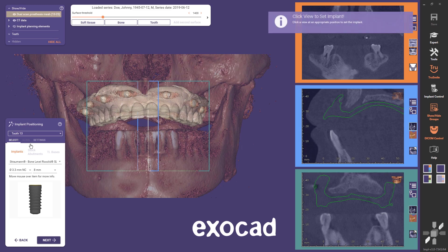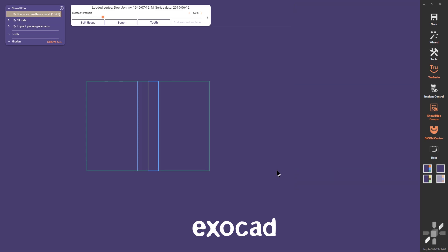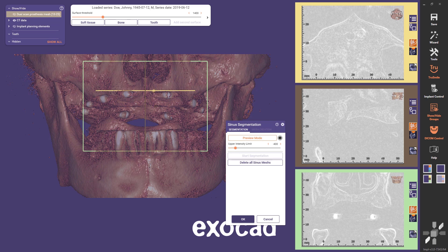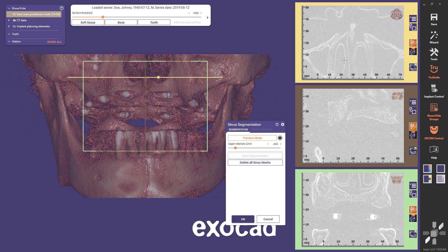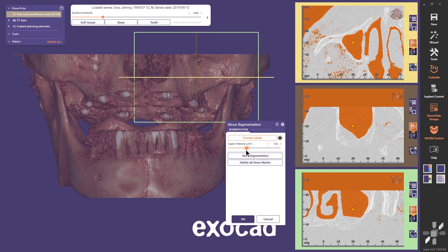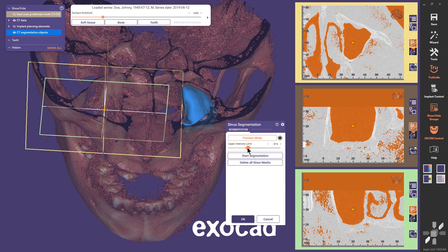Now we are in the implant positioning step, but before continuing to the implant placement, I will show you a new feature for maxillary cases. With this new feature, you can mark the sinuses. This step comes automatically in the wizard workflow if you are working in the area of the posterior teeth. Since I work on the canines here, I will switch to expert mode to show you this new feature, called sinus segmentation. I use the secondary axial view to locate the sinus area, click on one of the sinuses, use the slider to mark the area orange, and start the segmentation. I check the result, and if I'm happy with it, I can create a mesh that will react as a collision object if I come too close to it with an implant during placement. I'll create a mesh for the second sinus as well.